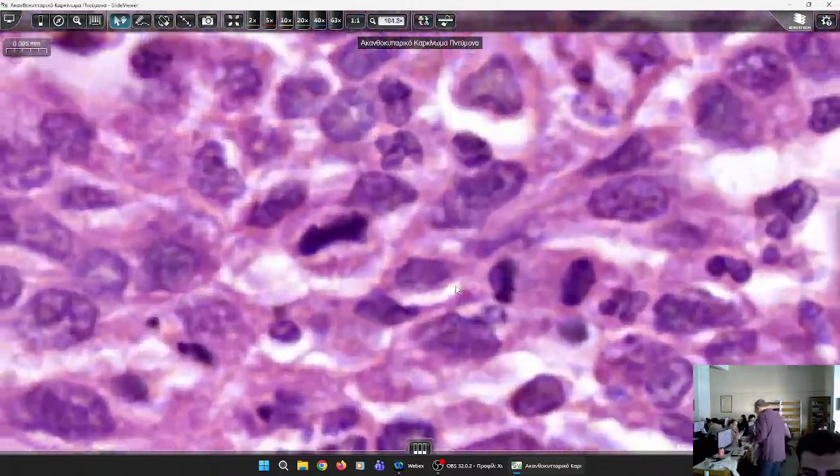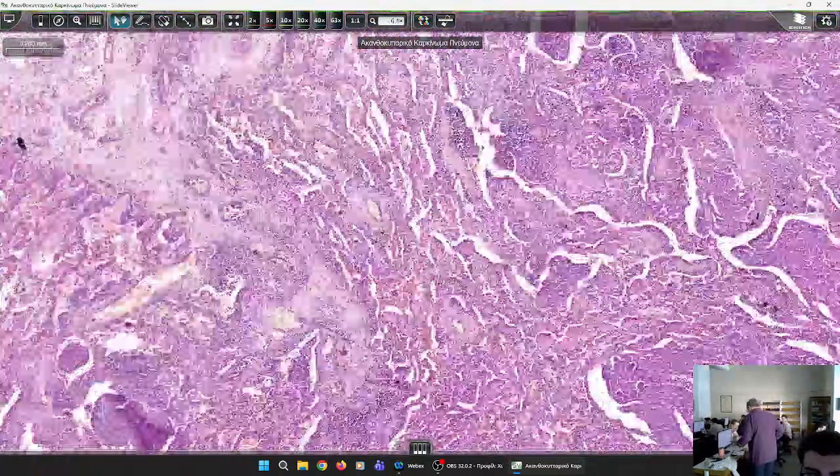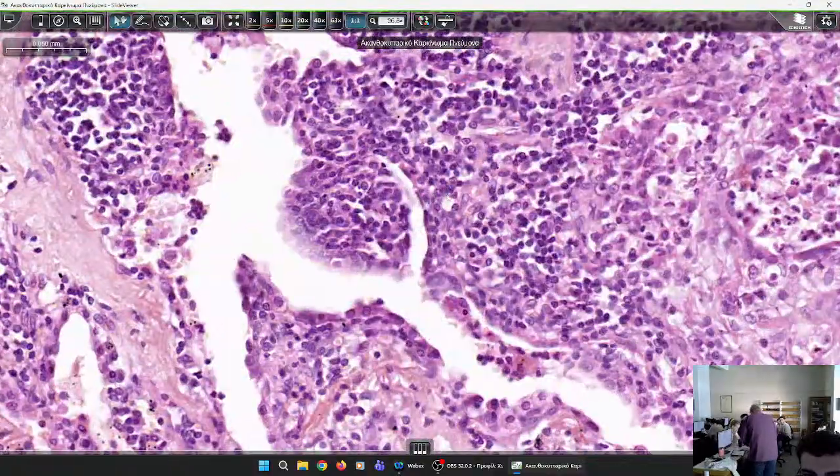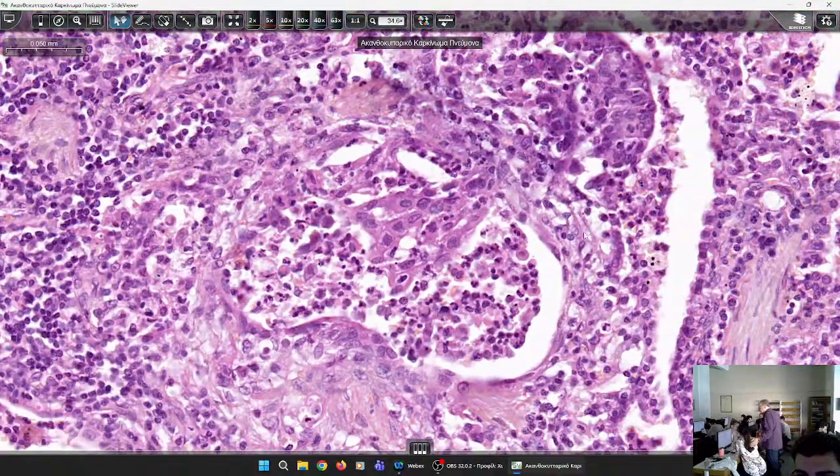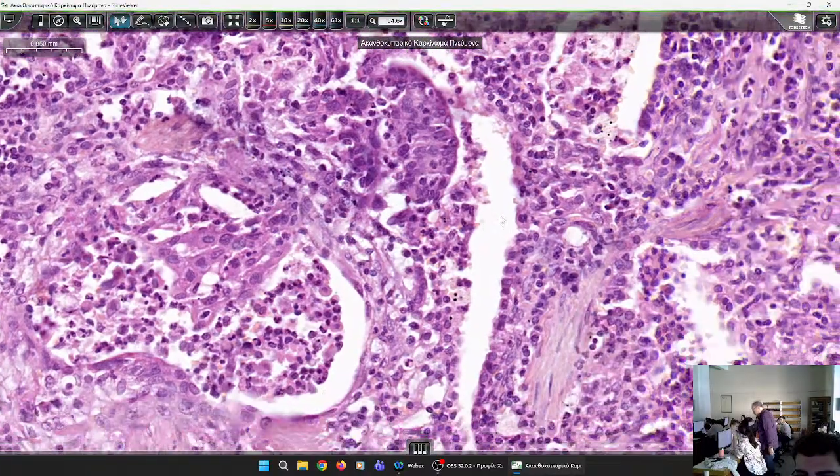So, did you find the malignant cells in your slide? Why didn't you open the slides? Why do you always take notes and don't study the slides? Do anything you like. No problem. Yes, please. Want to ask me something?